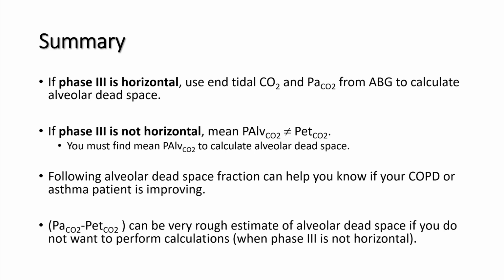If you really don't want to do calculation, P arterial CO2 minus P end-tidal CO2 can give you a rough estimate of alveolar dead space. The calculations would not be accurate if your phase 3 is not horizontal, but this is better than nothing.